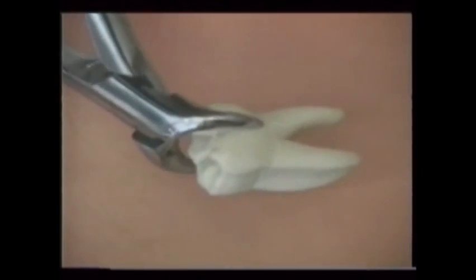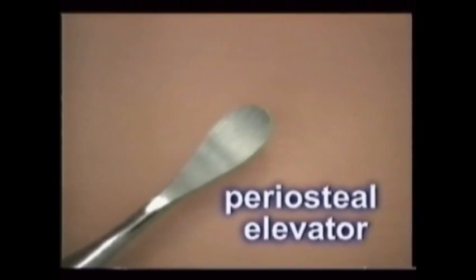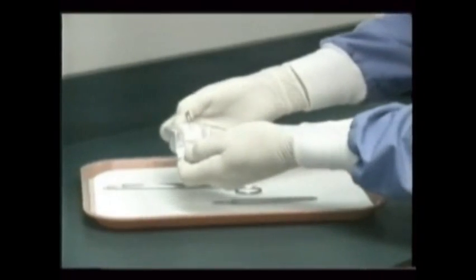If surgery is needed to correct bony defects, the bone must be safely accessed and exposed first by reflecting the gingiva. Beyond the gum tissue attached to the necks of the teeth, the wider blade of the dual-ended periosteal elevator is used to separate the thinner and more delicate gum tissue from the underlying bone. If the gum tissue must be laid back surgically to reveal needed surgery, or when a tooth's root breaks and must be surgically removed, precisely cut surgical flaps minimize tearing the gum tissue.